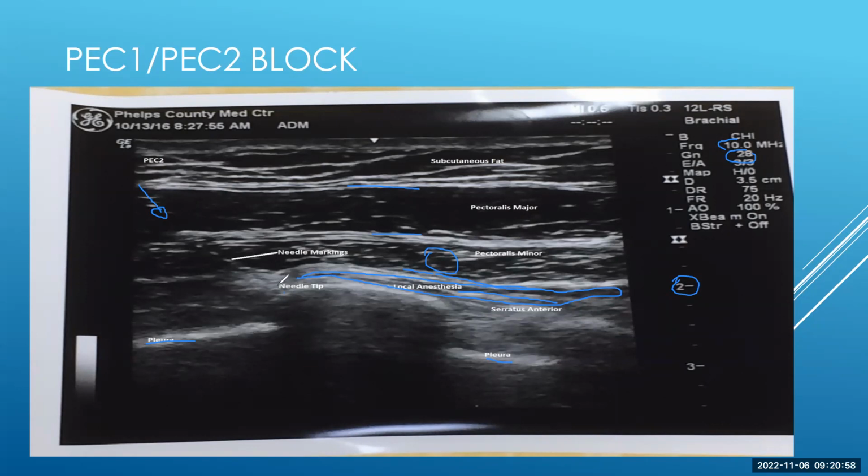If it was that easy, that we could always palpate the rib really reliably and encounter that rib or bony prominence pretty easily, then I could see that. But the problem is, what if we're right here and we're like, well, let's adjust a little bit. We go in here, and then we basically just gave them a pneumothorax.